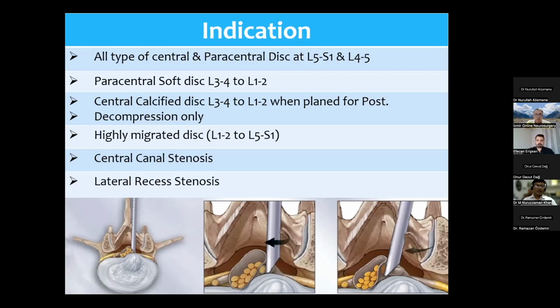Even foraminal stenosis can be dealt with the para-interlaminar approach, that is, it also can be done.